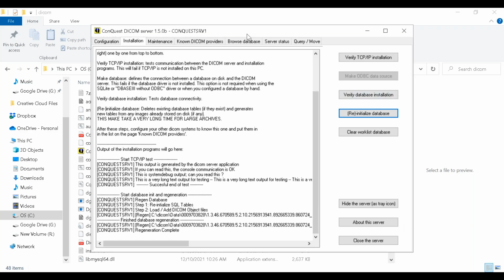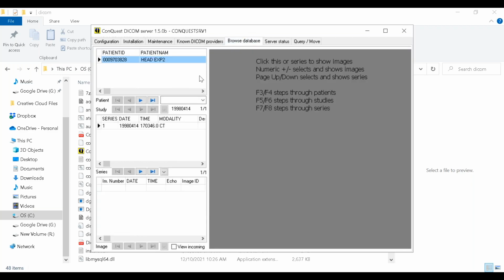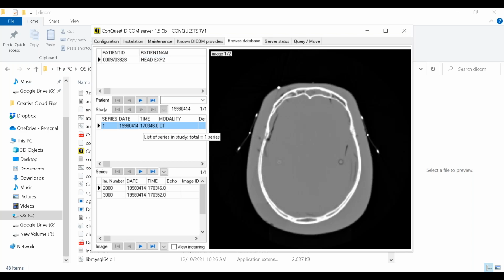Also, one of the things I like about the server is it has embedded in here, well, it's supposed to be an image, and it usually does display, but for some reason I'm not able, there we go, to display the images. So this is broken down by study. This is the series. Does anyone know the difference between a study and a series?